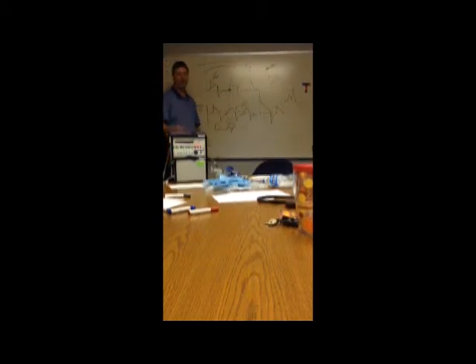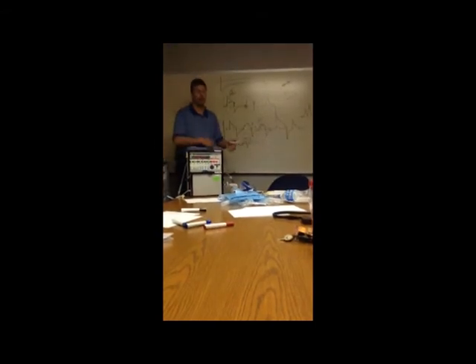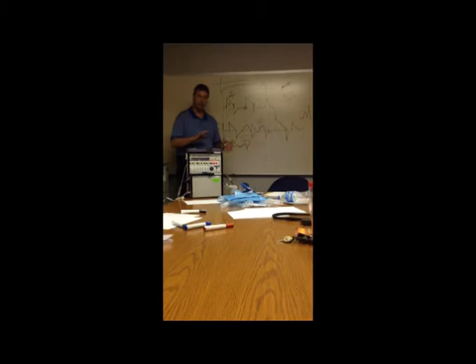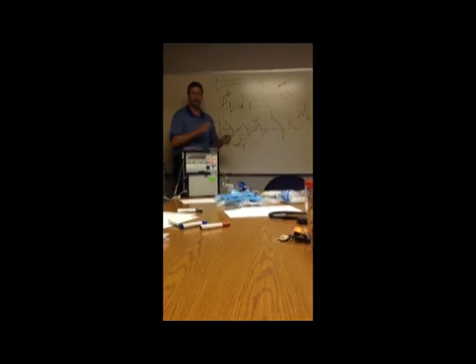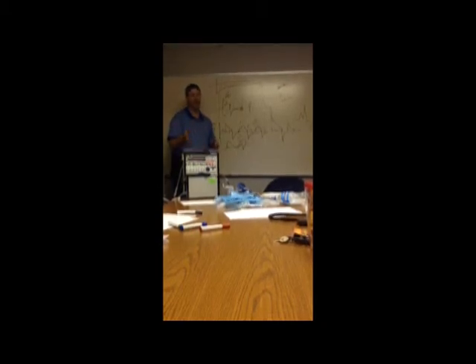So if I have anybody on this, since your vent's weird, but it's cool, all right, and their tidal volume is decent, say it's 500, and that's maybe a little big for somebody as tiny as she is, or you just think it may be a little bit bigger. If you want to do the math, mils per kilogram, fine. We use 4 to 6 on most patients.